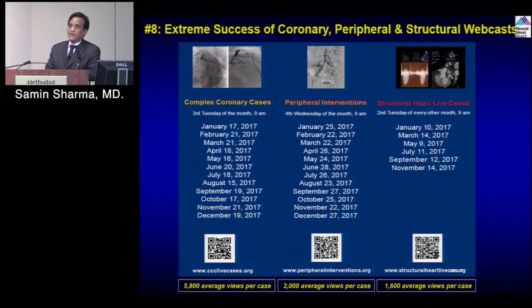So now coming back to the point, what is the preferred approach? DK crush is a multiple-step technique, we don't use that often, but mini crush. For the left main, maybe SKS, but for the rest of the non-left main, the mini crush technique for two-stent bifurcation is the preferred approach, and that is being used in about 28% of the bifurcation lesions at Sinai.